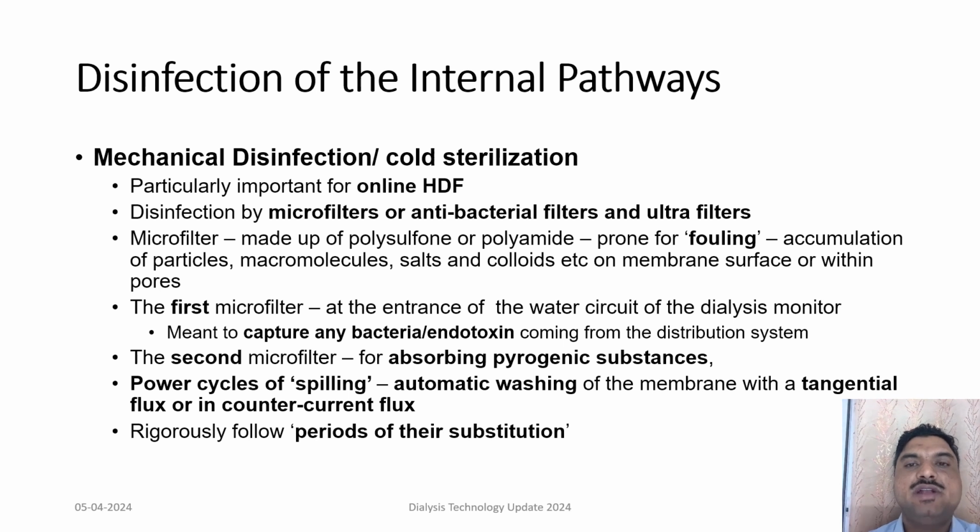So these microfilters are usually two when applied in online HDF. The first microfilter is usually at the entrance of the water circuit of the dialysis monitor, which is meant to capture any bacteria or endotoxin that is coming from the dialysis distribution system. The second microfilter is there for absorbing any pyrogenic substances. So these microfilters also need to be cleaned.